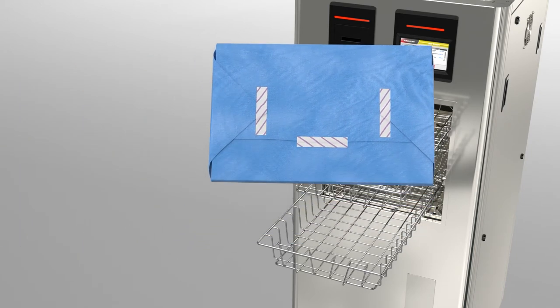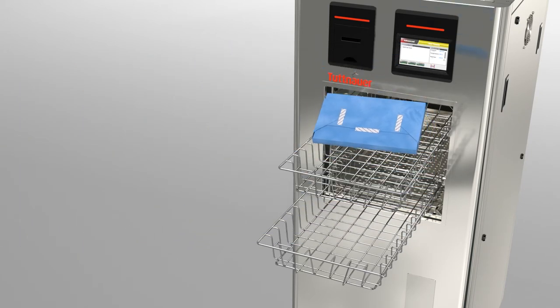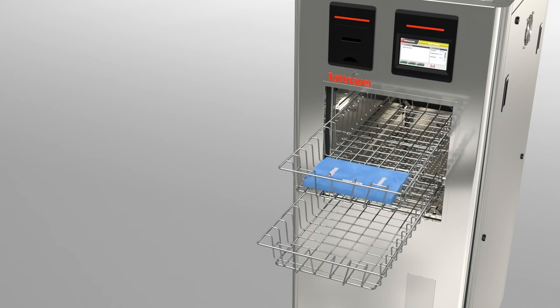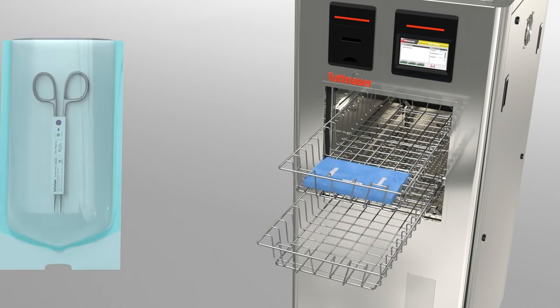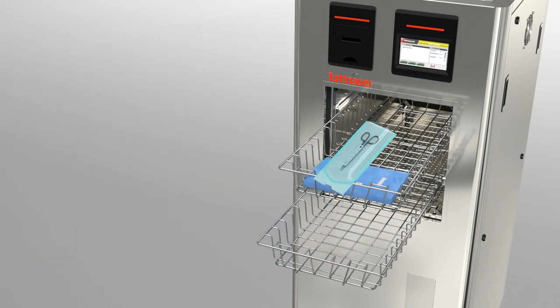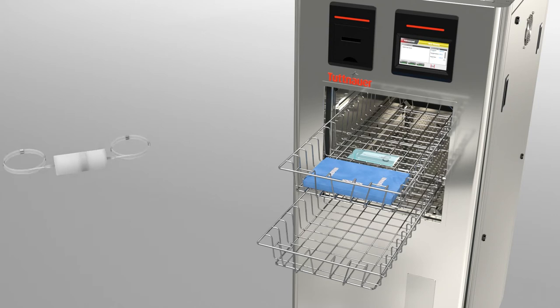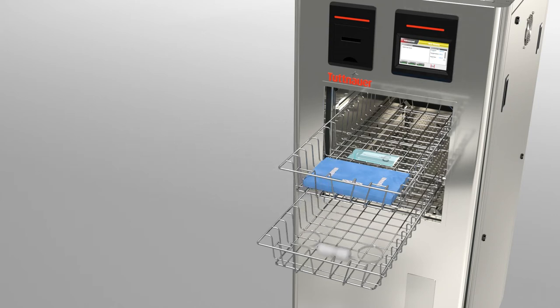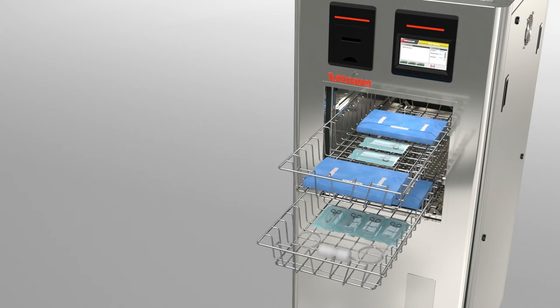The load with the indicators is placed onto the Plasmax trays. Chemical indicators can be placed in four corners of the chamber to validate the process.